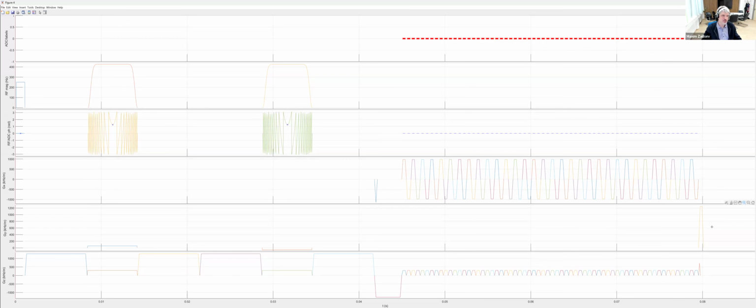In your particular case, it's actually even simpler. So what you can do, you can manually create a gradient, which is a ramp up, and it stops after the ramp once you reach your nominal gradient strength. And then for all other blocks, you can use this extended trapezoid gradient, which can start at any value and end at any value. And a special case of that is the gradient which starts at a constant value and ends at exactly the same value and only has the flat part, right?